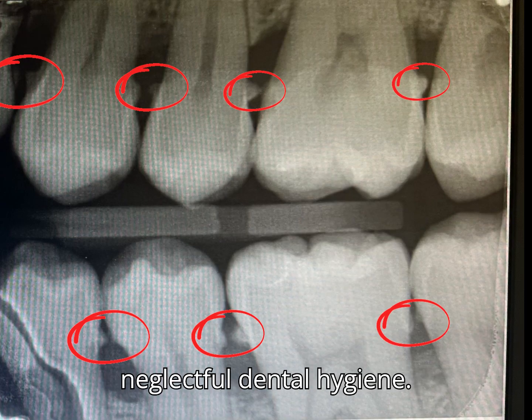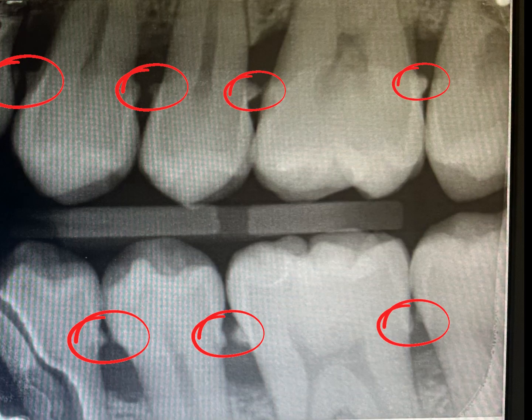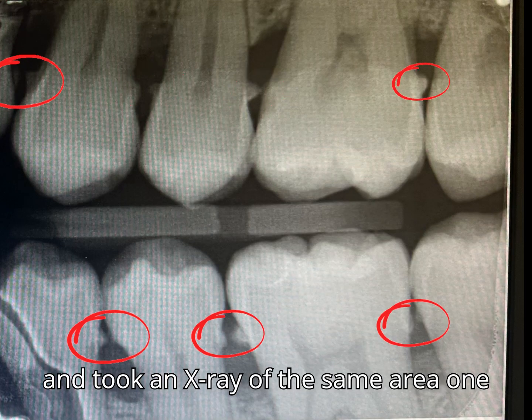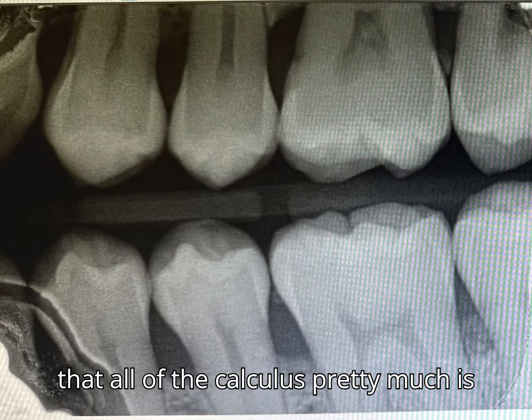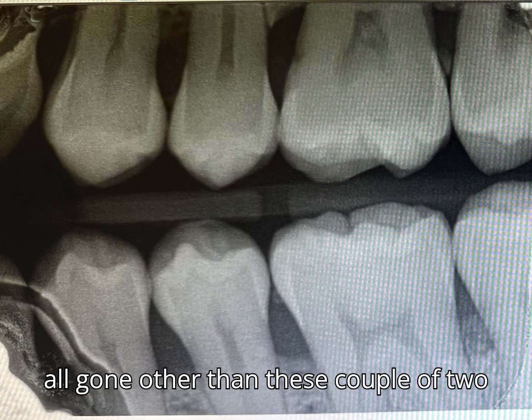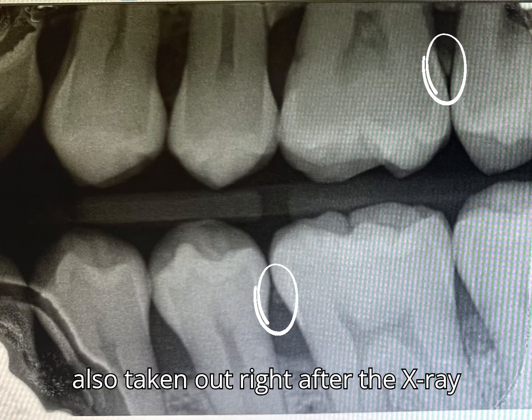So I did a deep cleaning for this client and took an x-ray of the same area one more time, and you can see that all of the calculus is pretty much gone, other than these couple of loose pieces you can see here, which were also taken out right after the x-ray was taken.